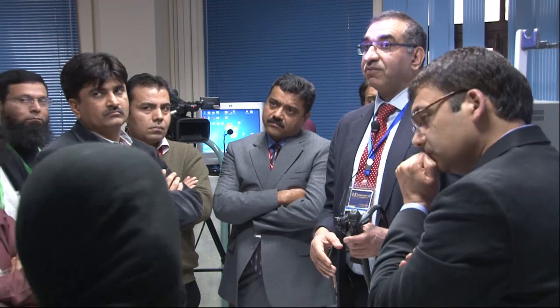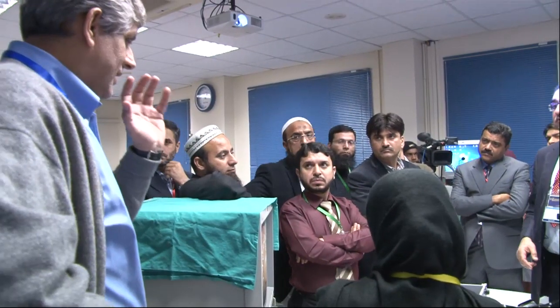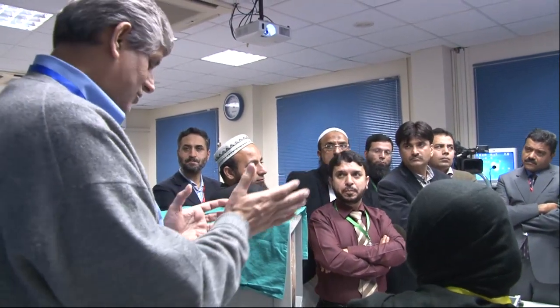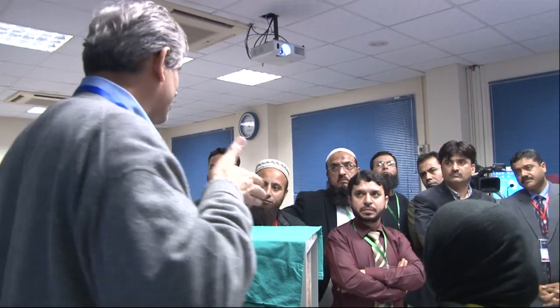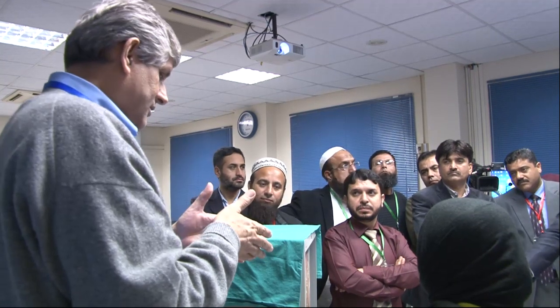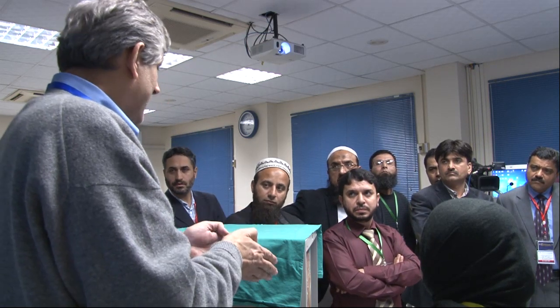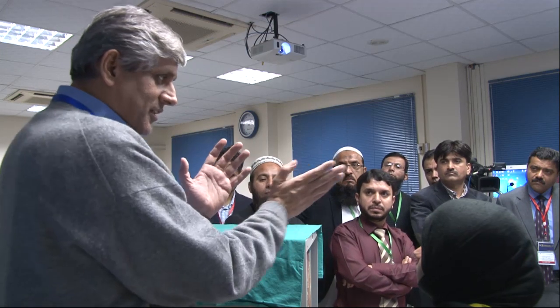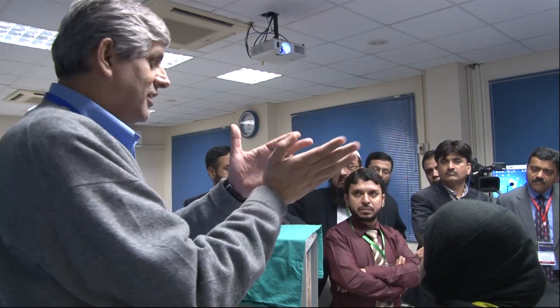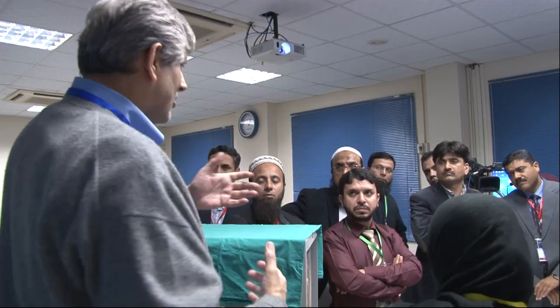So one of the things that I've learned when you enter the stomach, what I was trying to show here with the dummy, obviously not here, is that when you enter the stomach, you have to go here. And what happens is your tendency is just advancing. As soon as you pass the gastroesophageal junction and go down to the stomach, it's time to just gently take. You'll see that the gastric goes literally like right, it literally guides you most of the time. You never see yourself struggle, go back.